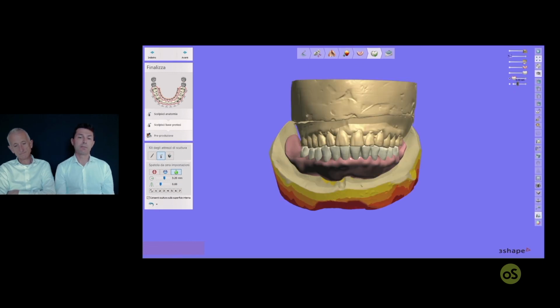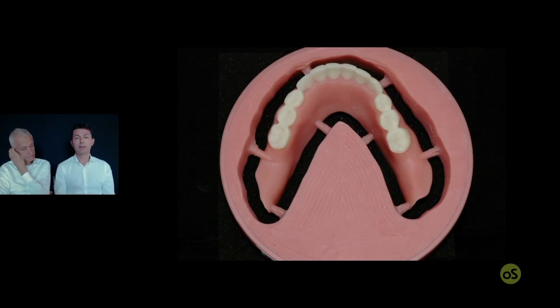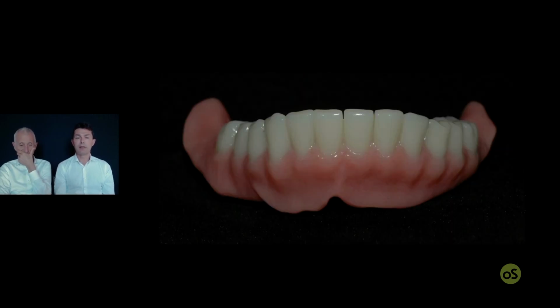And for us, it is good because the midline is good, the occlusion for sure is good, and the shape is good for this patient. And now the facility milled the two parts of the restoration for us, the pink and also the white part, glued in one piece. And more or less it is a mobile prosthesis for the patient. Now it's time to open the slot for the well-done framework, and the digital denture is ready for the mouth.